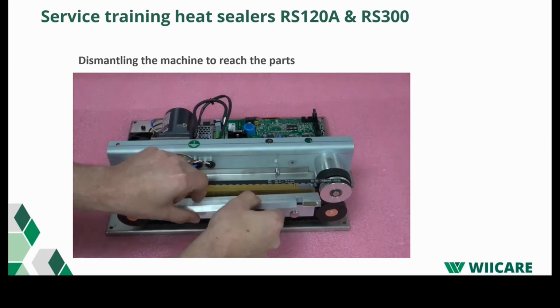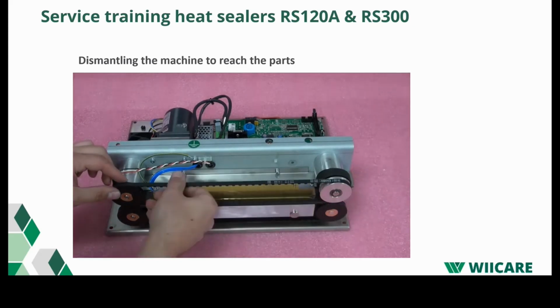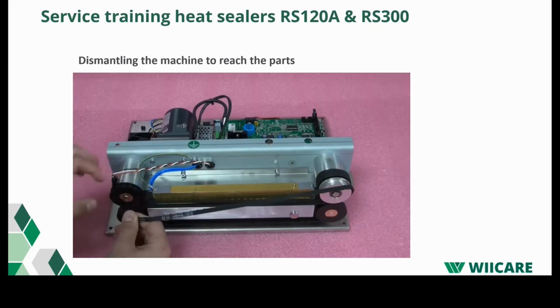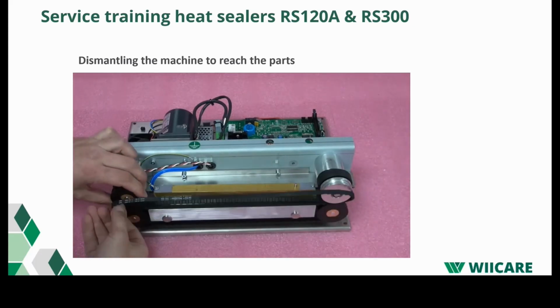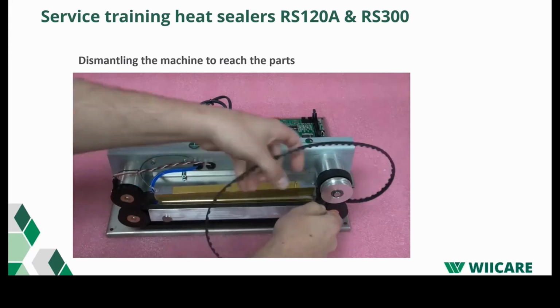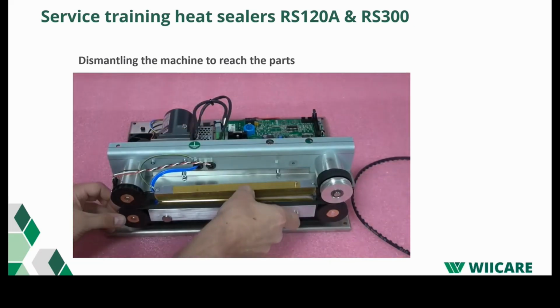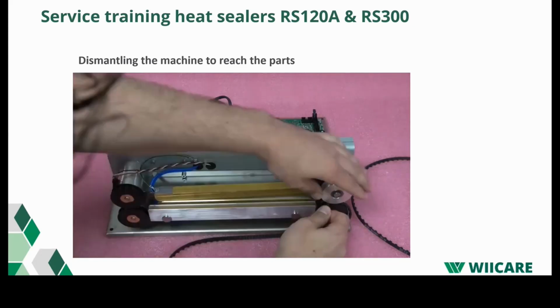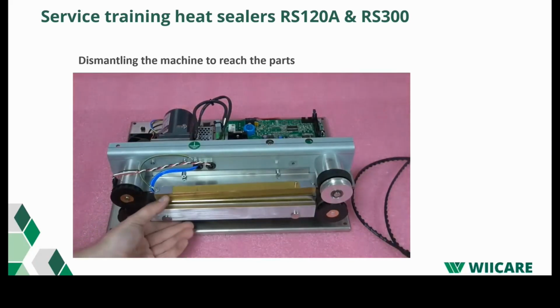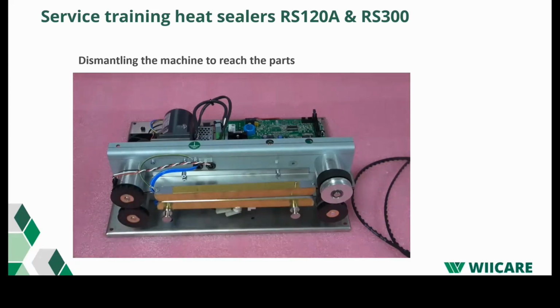Remove the top guiding bar. Now you can pull off the transport belts. Remove the lower guiding bar. Now we can disassemble the pulleys.